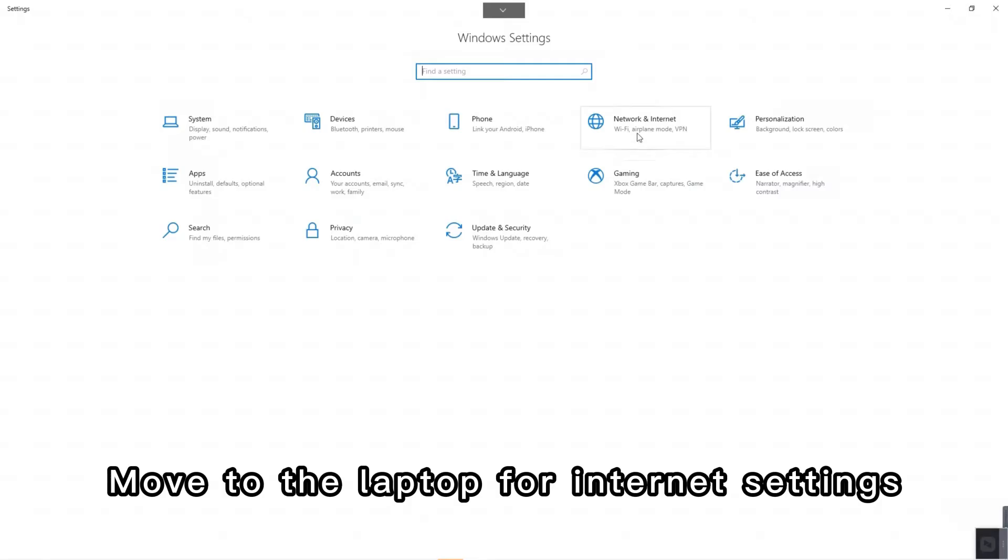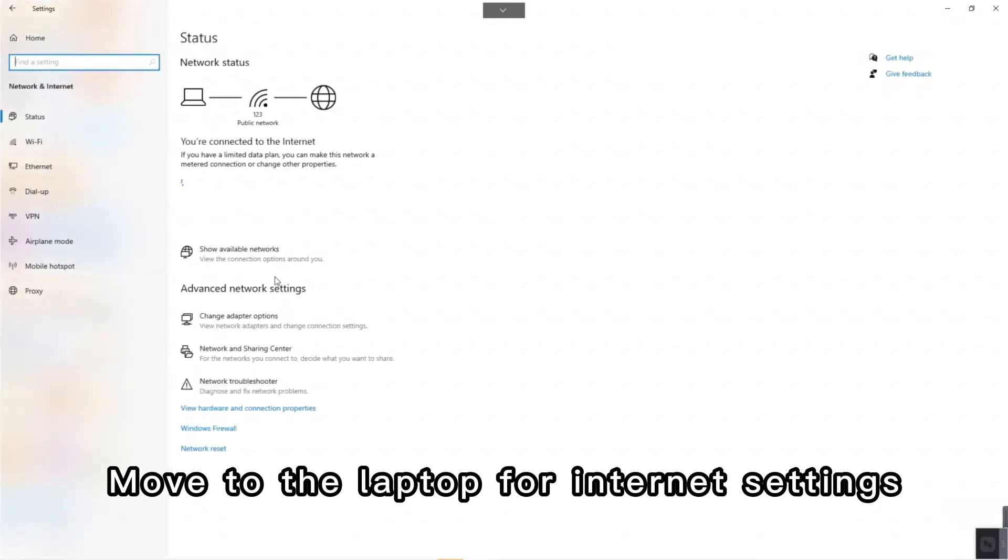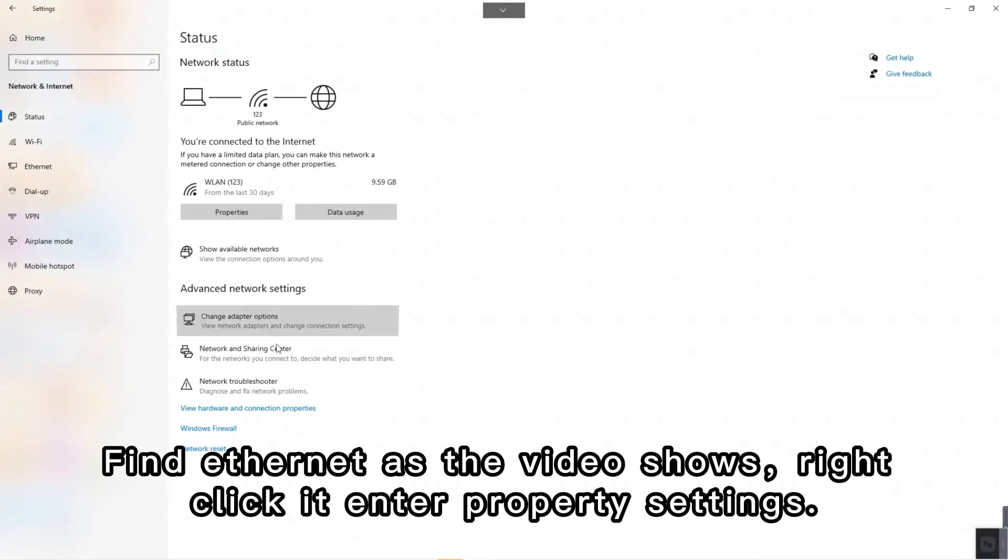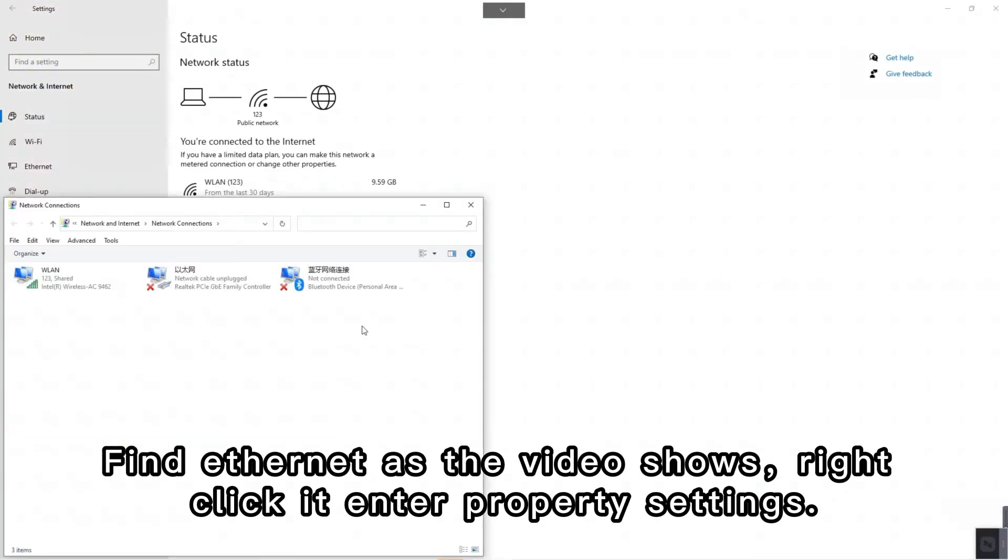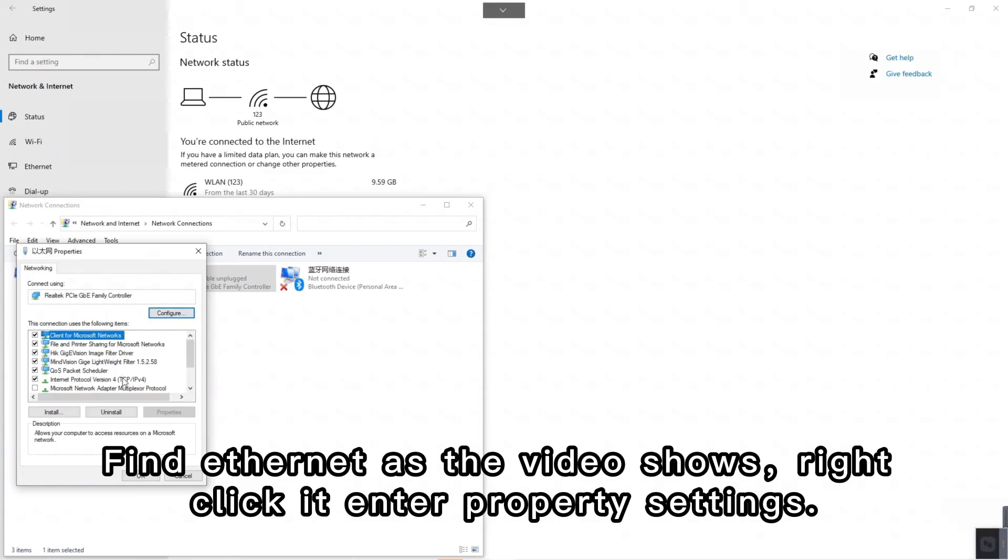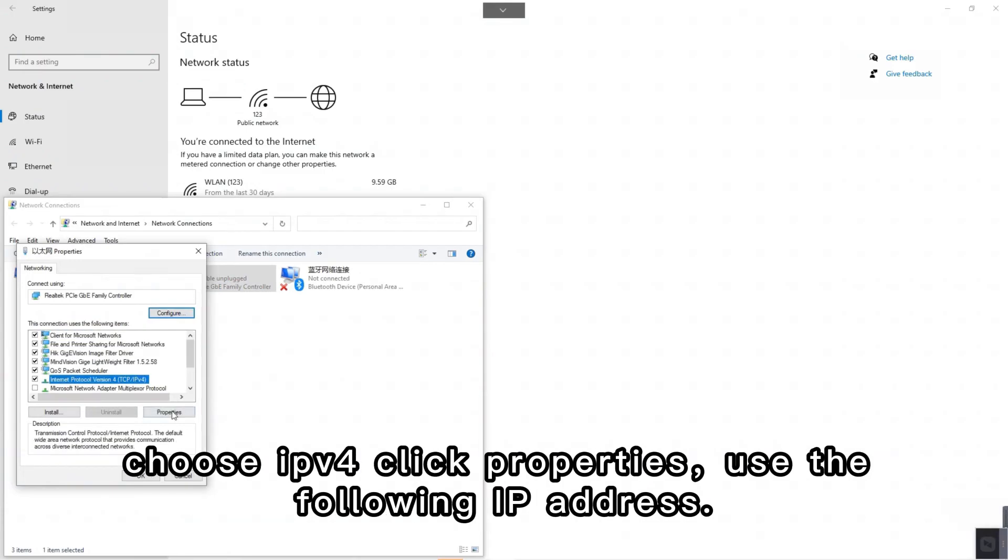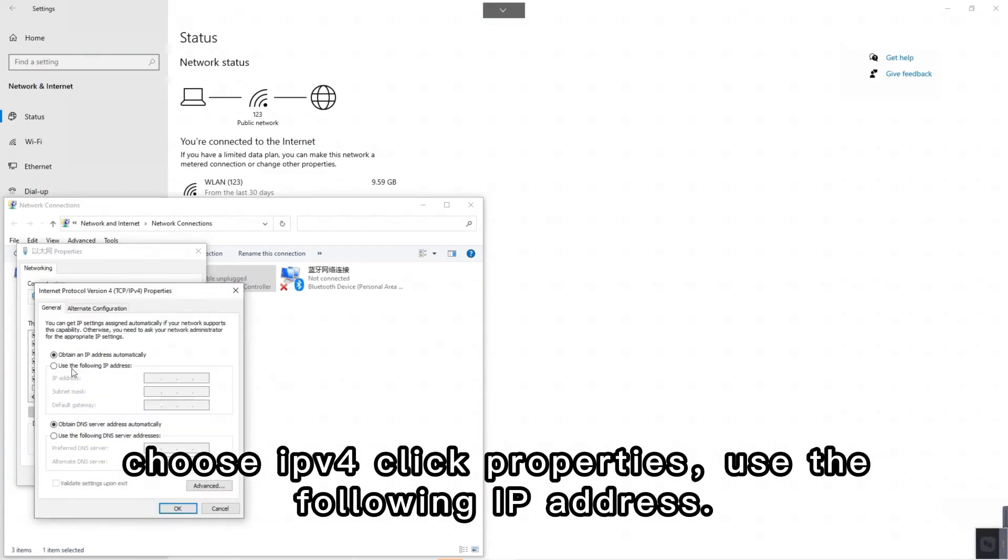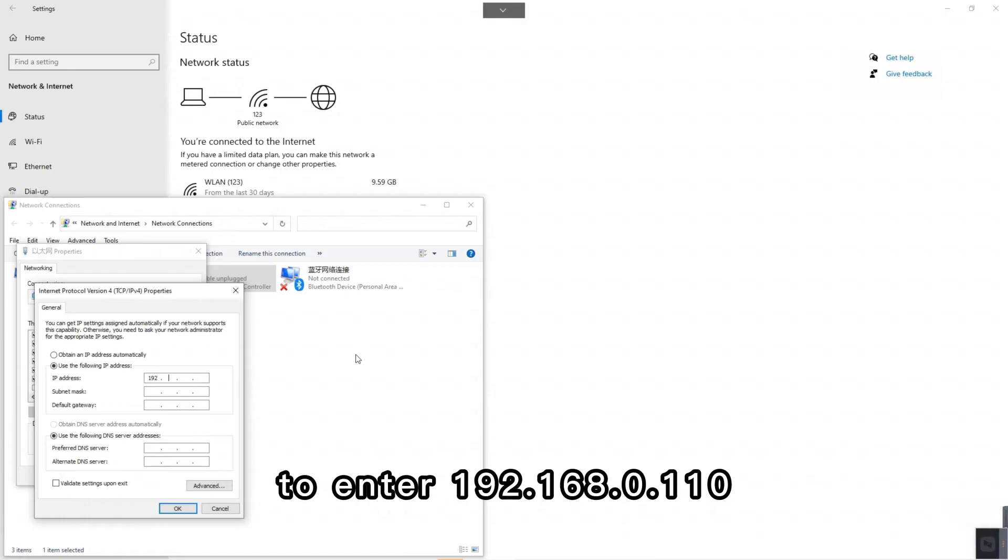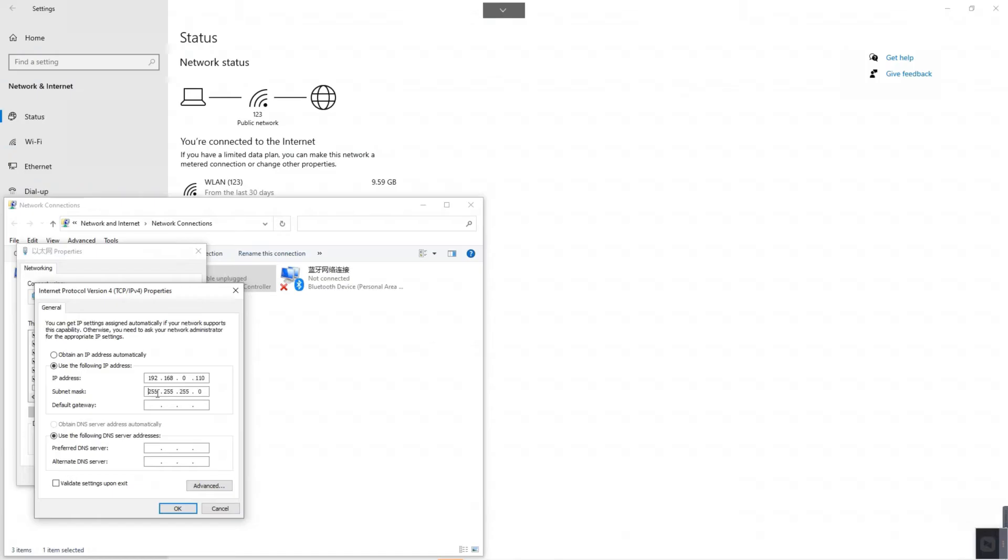Move to the laptop for internet settings. Find ethernet as the video shows. Right click it to enter property settings. Choose IPv4. Click properties. Use the following IP address to enter 192.168.0.110. Click OK.